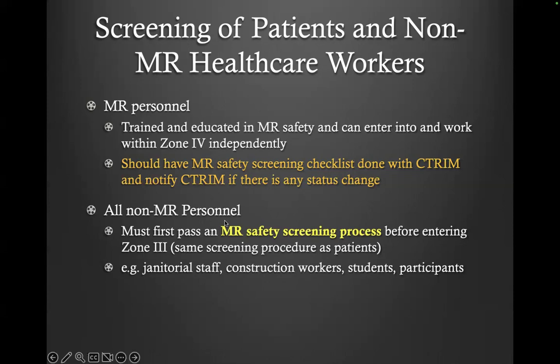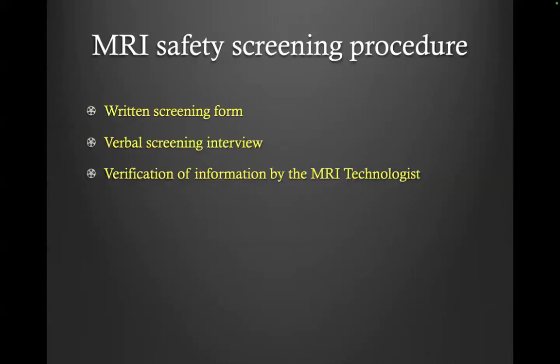For all non-MR personnel, you must first pass an MR safety screening process before entering Zone 3, likely the same screening procedure as patients. That includes janitorial staff, construction workers, students, participants, visitors, or anyone who is not trained yet. The MR safety screening procedure includes a written screening form, verbal screening interviews, and verification of information by our technologist.